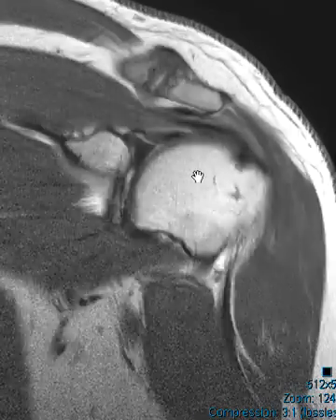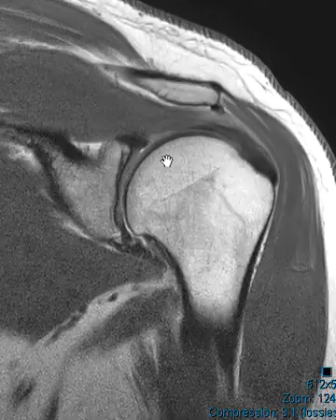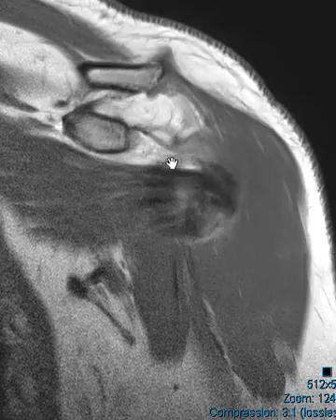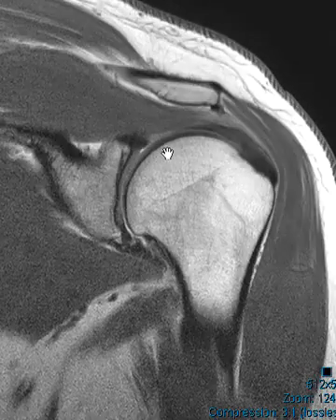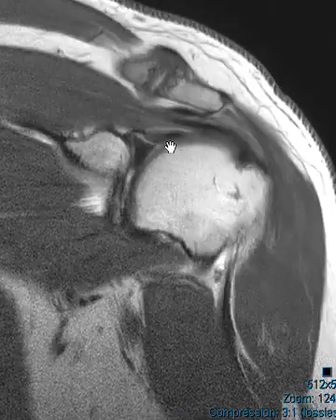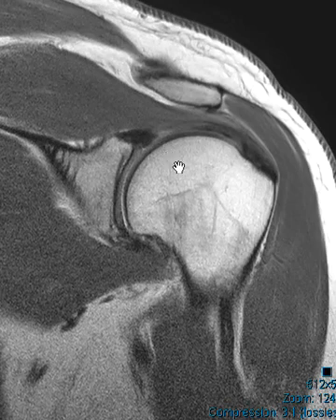Over the past many years, I've been using a different technique where I'll have the patient externally rotate, and I'll put the needle maybe right above the subscap, right about here. I aim right in this area, just above the subscap and below the biceps. Here's the biceps coming over the top and there's the subscap — a really narrow little area. Somewhere near the top of the subscap, near the top, and you go straight in, about right here.